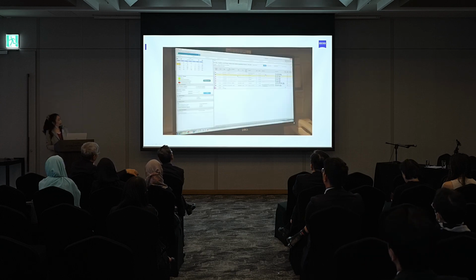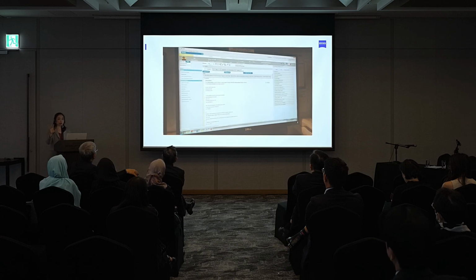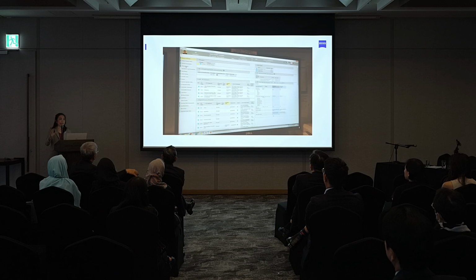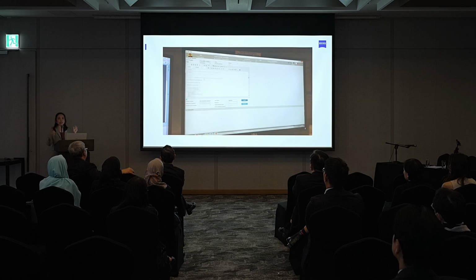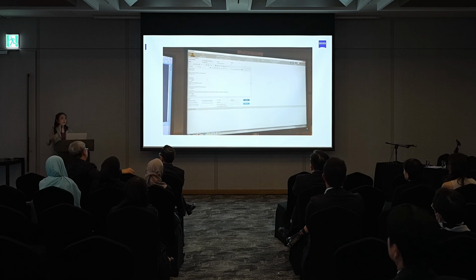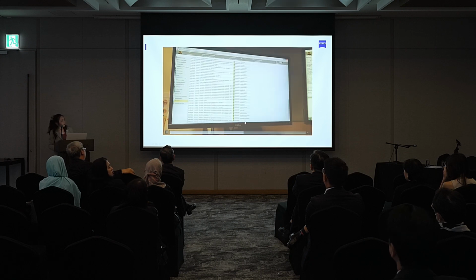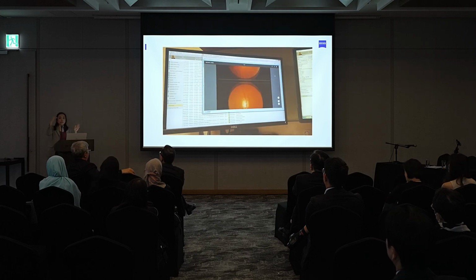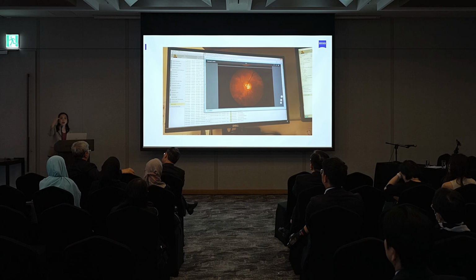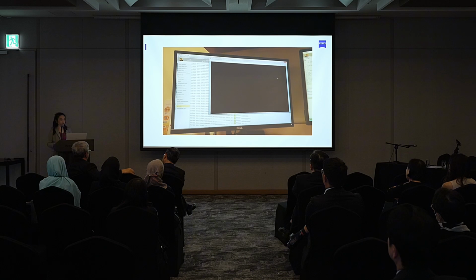But when we move to the EMR, definitely no paper, a lot better. But the EMR itself does not exclusively handle ophthalmology for you. They have lots of EKG, PACS, MRI, and when you list them here, there are lots of things that you have to take care of. You have to sequentially see the fundus photograph on that day, on this day, the zoom in, the zoom out, the right eye, left eye. There are lots of things also.